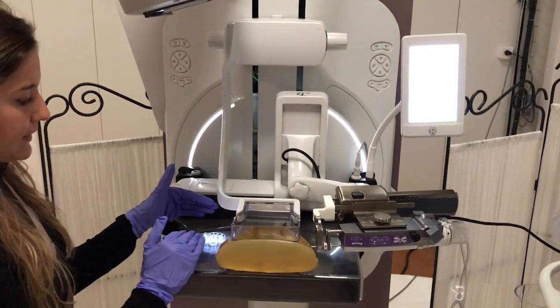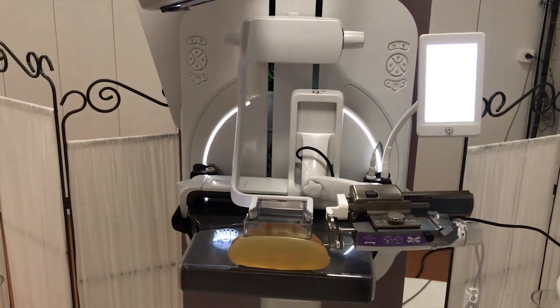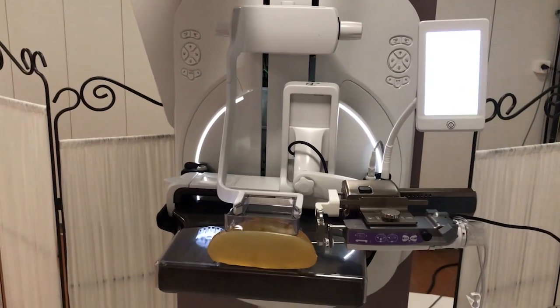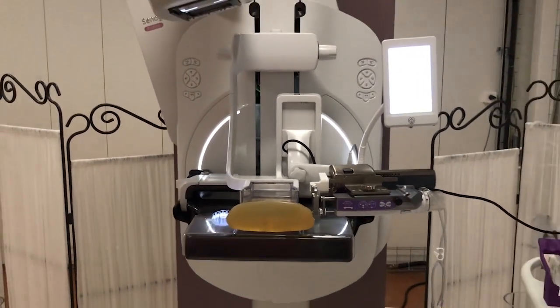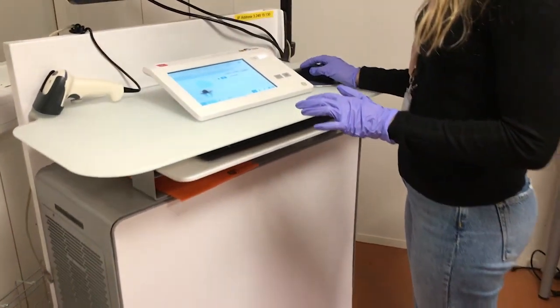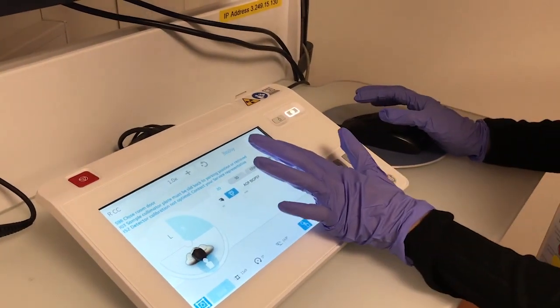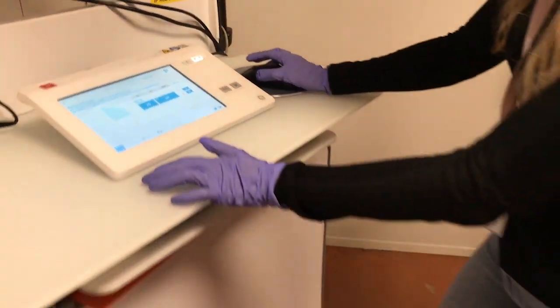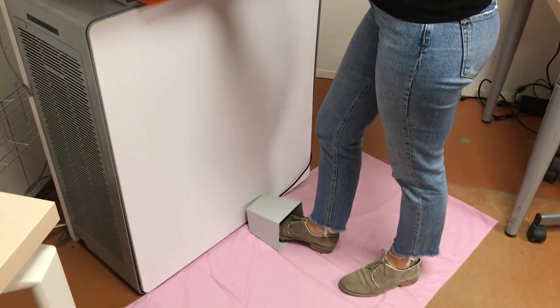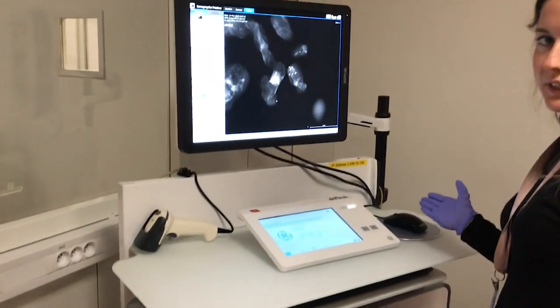Once the sample is set into place on the dedicated area, you can move over to the control station to get ready for the acquisition. On the x-ray console you just have to choose the sample procedure, and then with the x-ray foot switch you can go ahead and acquire the image like any other.